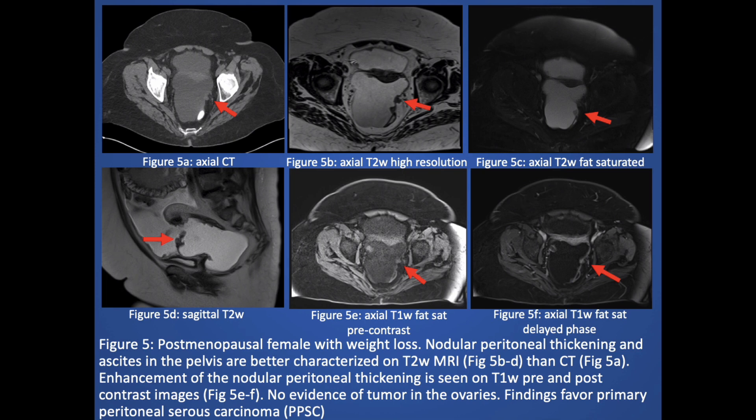Here is another case of a postmenopausal woman with weight loss. There is nodular peritoneal thickening and ascites in the pelvis, better characterized on the MR images. There is enhancement of the nodular thickening seen on the post-contrast images, and there is no evidence of tumor in the ovaries. These findings are consistent with primary peritoneal serous carcinoma.